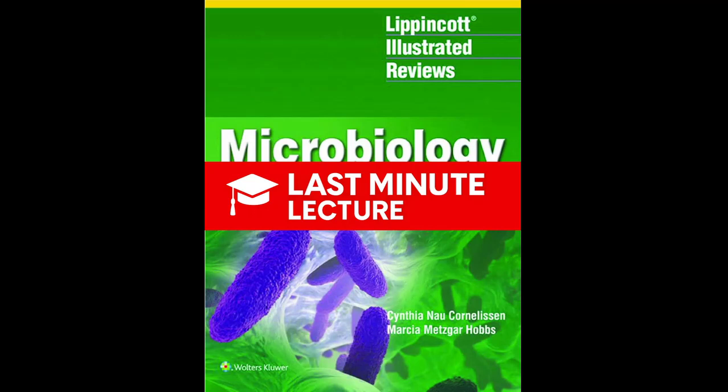But sometimes growing the bug takes way too long. That brings us to immunologic detection, serology. Right, so this flips the script. Instead of looking for the bug, we can look for evidence of the bug, either a piece of the bug itself, an antigen, or the body's response to it, an antibody. And the antigen tests are all about speed, right? Totally. Think about latex agglutination.